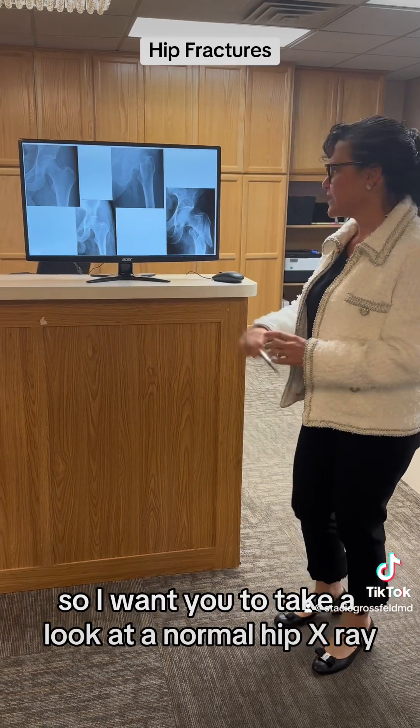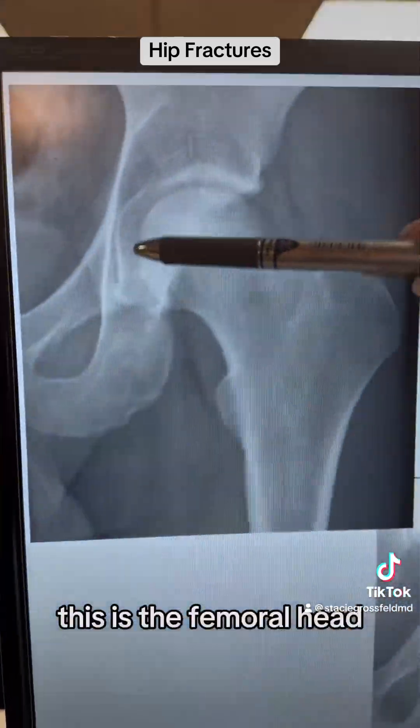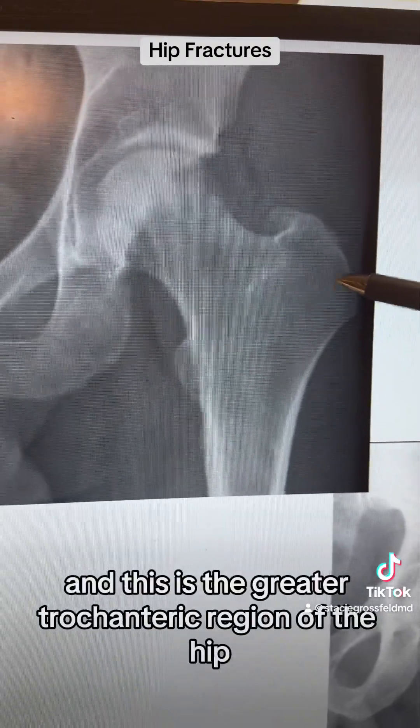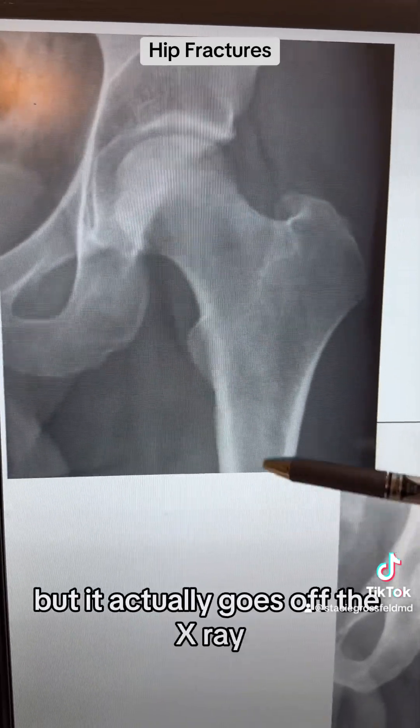I want you to take a look at a normal hip X-ray. This is the femoral head. This is called the femoral neck. This is the lesser troch, and this is the greater trochanteric region of the hip. And then this is the shaft of the hip, which goes off the X-ray.